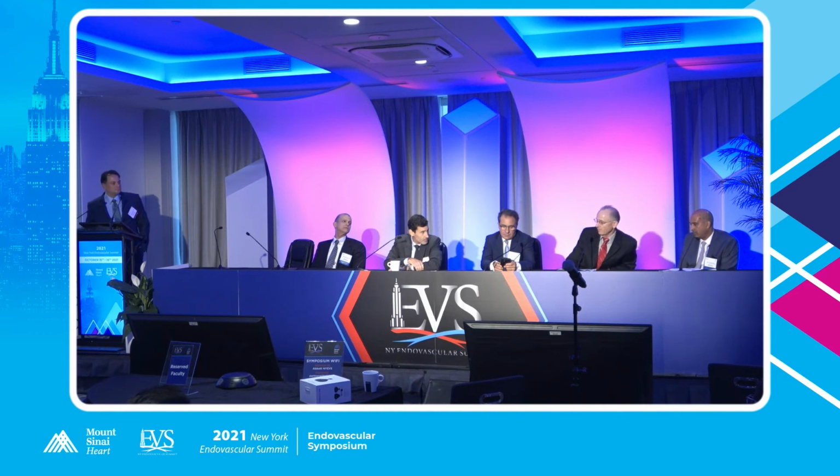I tend to leave nothing behind because of our conversations we had mentioned. So in that case, I would have probably preferred to put a drug-eluting balloon after I'd done atherectomy. And if I had no elastic recoil after watching it for 10 minutes, then I would try to leave nothing behind and not put a stent in it. Otherwise, I have no problems. I've been reaccessing stents for 28 years that I've been at Ochsner.